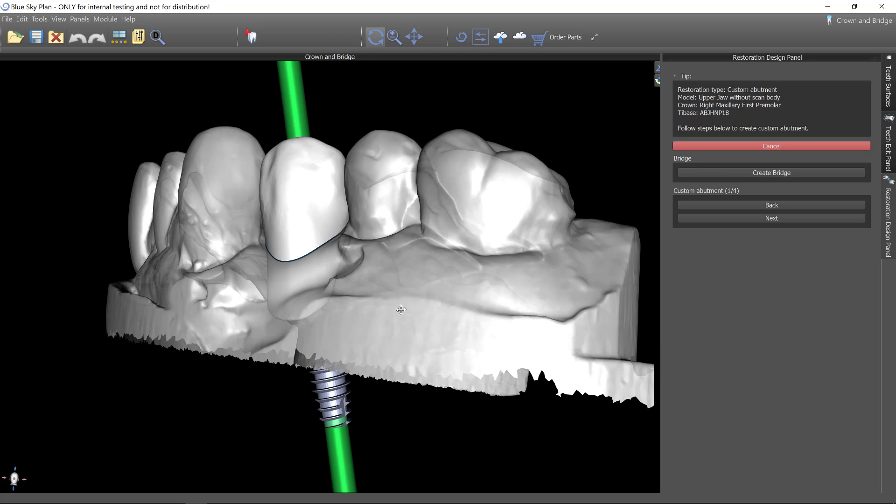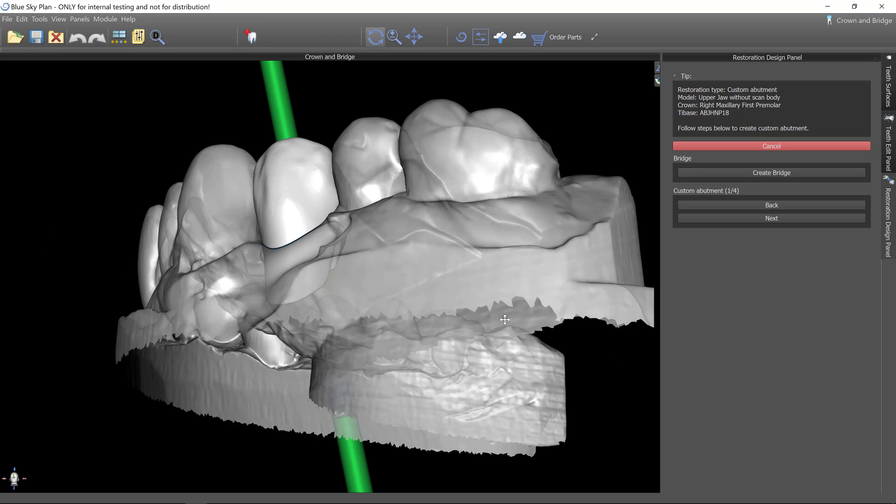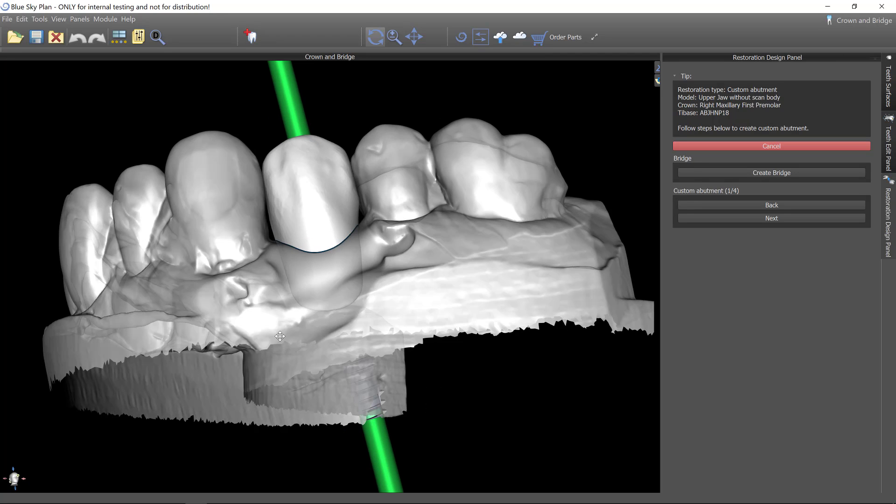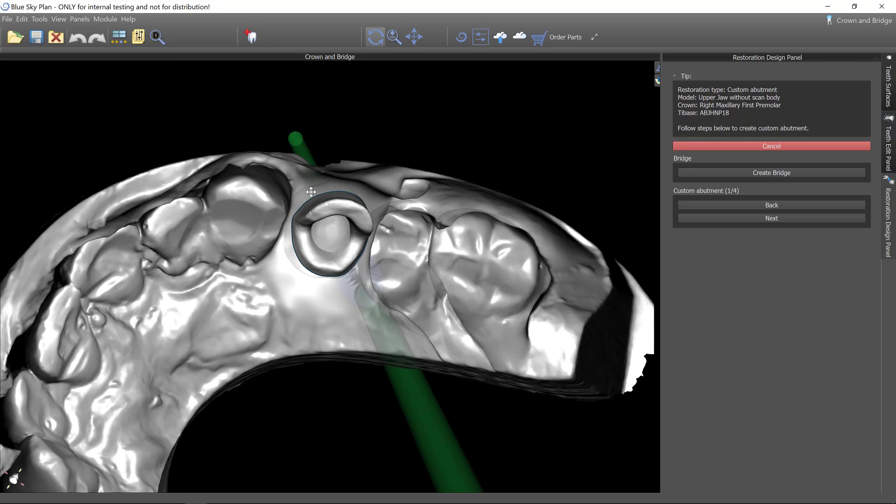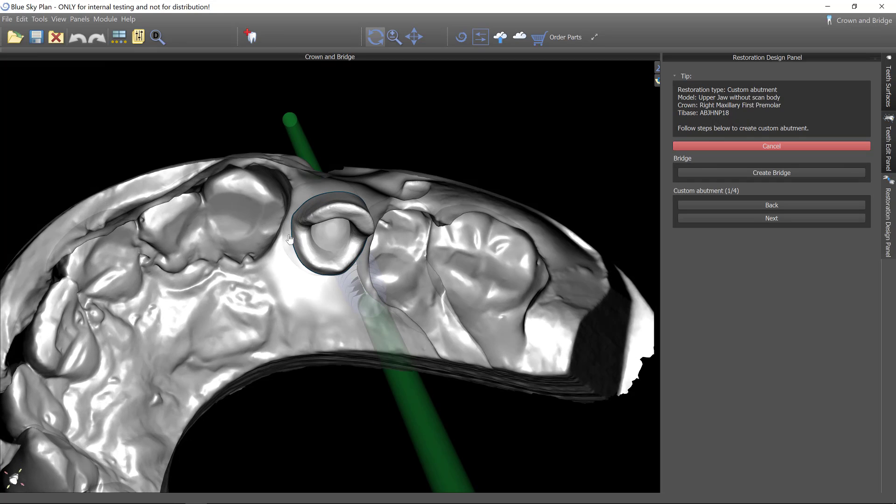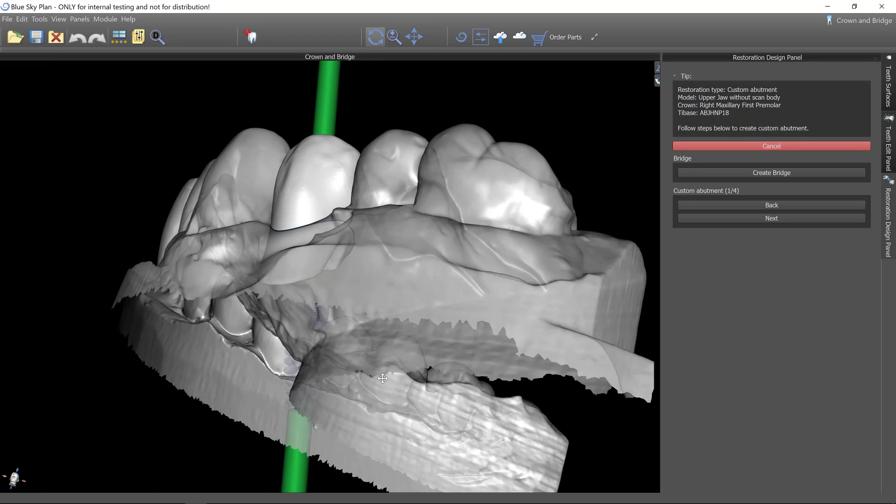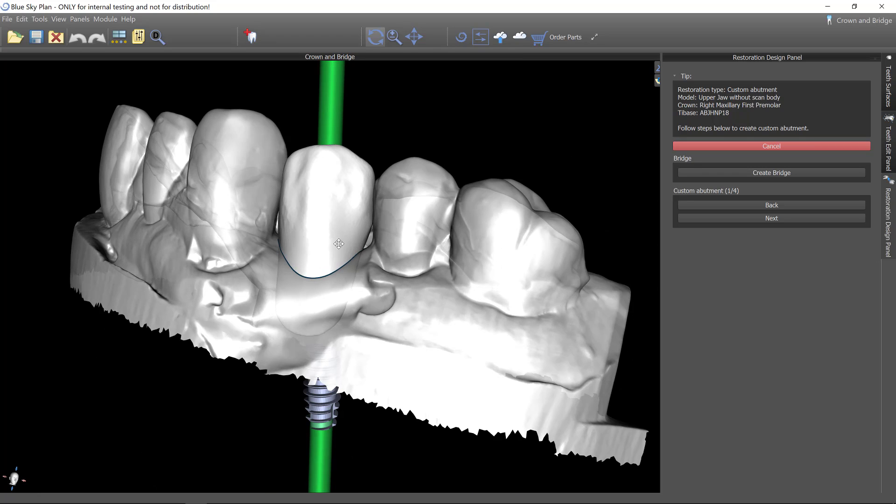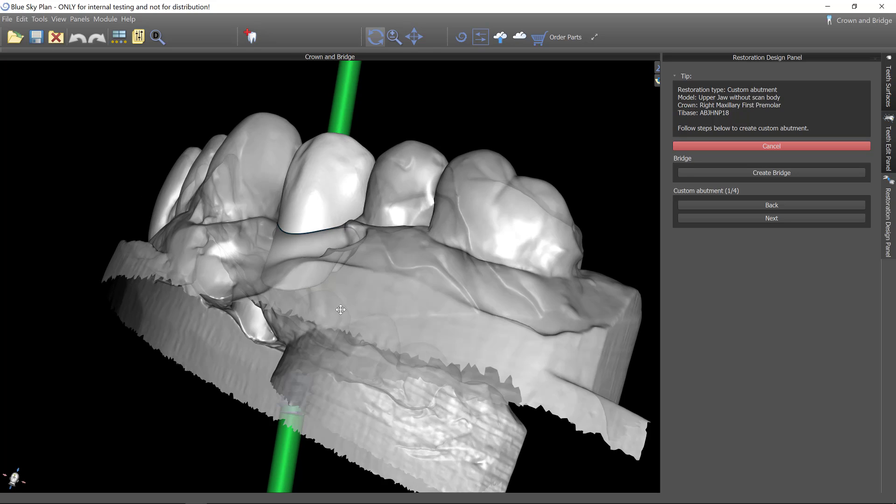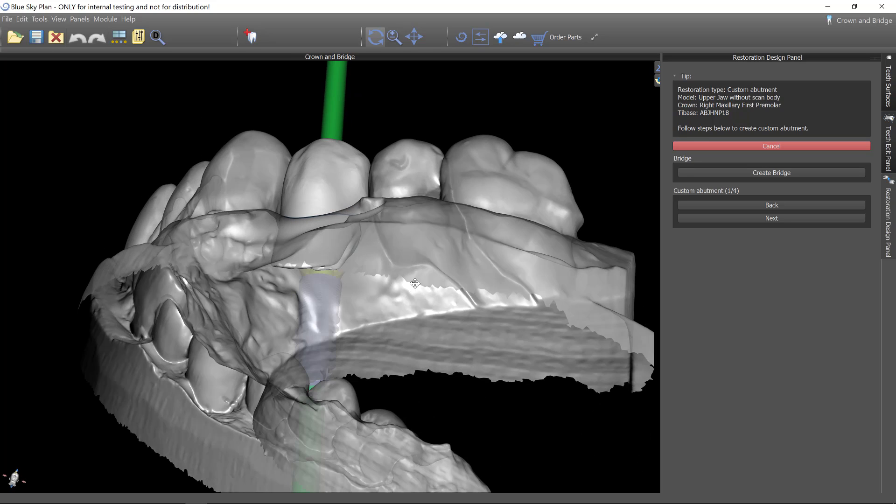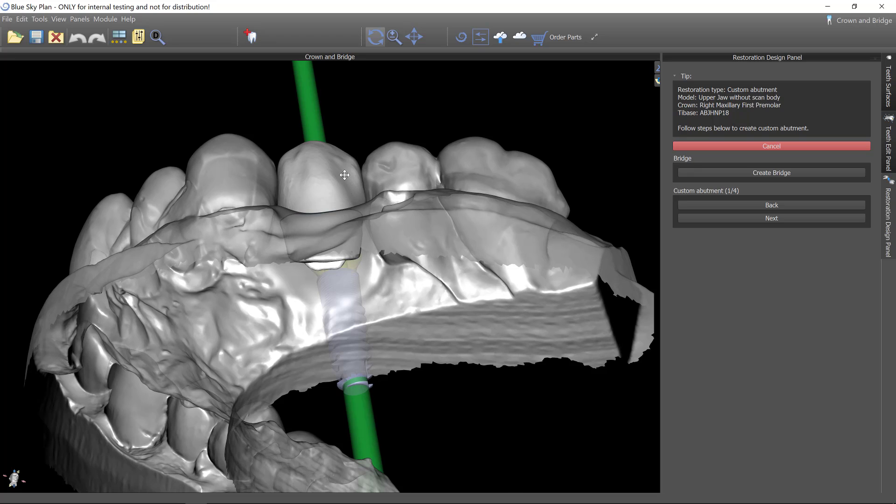And so what you're going to see is that now the software, it calculates the intersection between the model, the gingival model and the crown. This is why you want to design this crown as nicely as you can, where it's contoured to the gingiva correctly because the software is going to base the abutment margin on that.